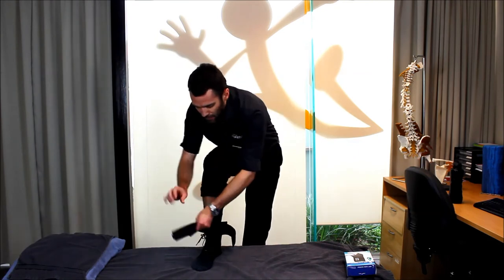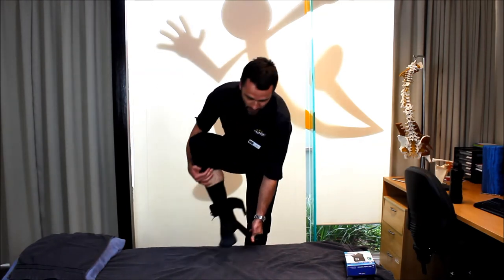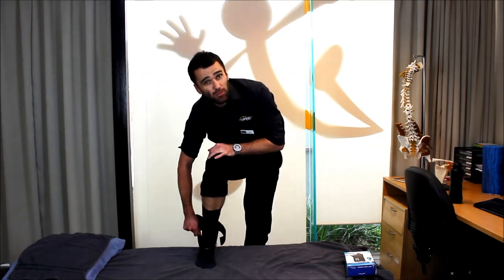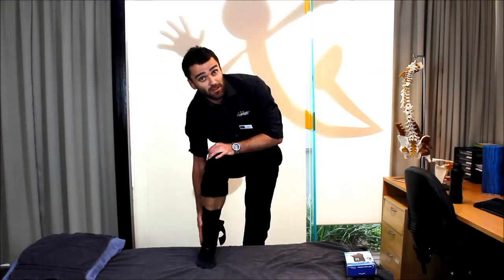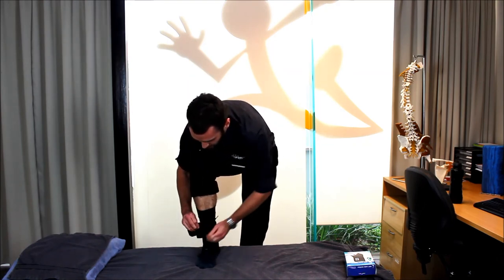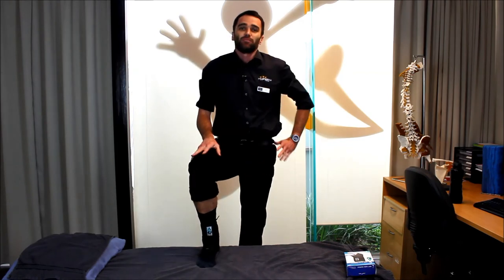You take your other strap — and here's where the laces will be taken care of. You can just keep those laces out of the way, come up around the outside, and in that position pull quite firmly so that you've got a nice snug fit with plenty of support along the outside aspect of the ankle. Then finally, just to tie up all the loose ends, you've got an elastic strap here — stretch it across so that those laces are nicely covered, and presto, you're done.